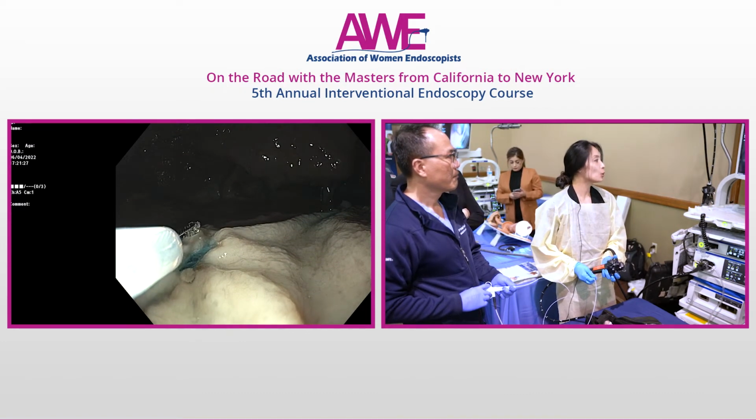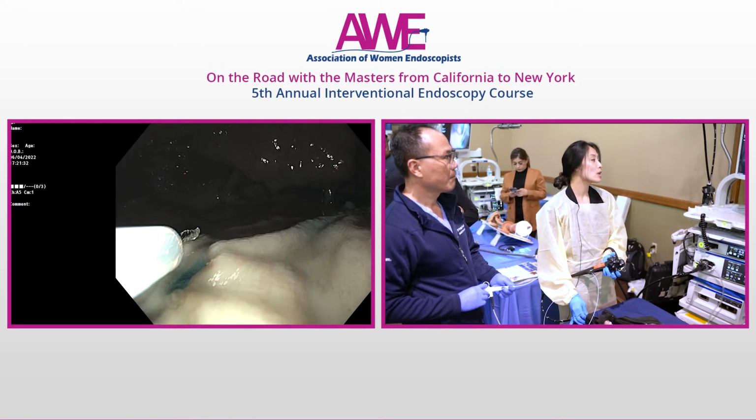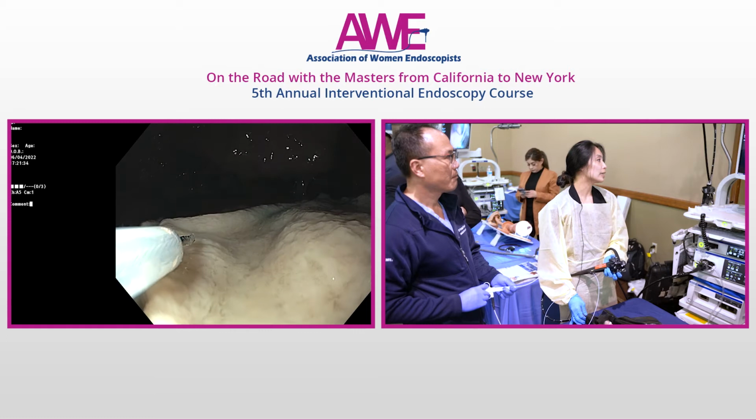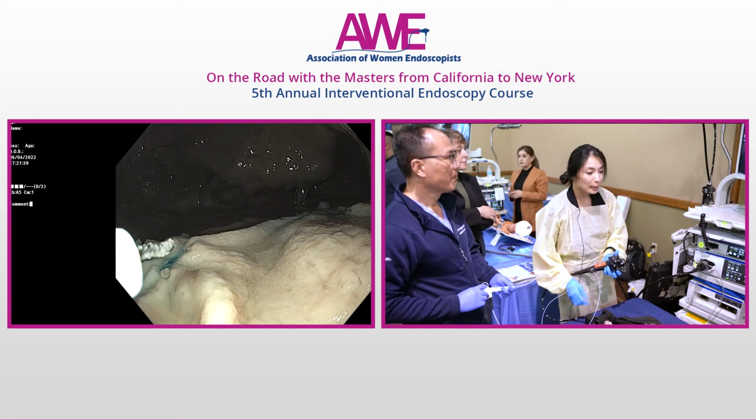And then, as mentioned in the lectures this morning, we can also use the snare tip to just go around the margin of the lesion to decrease the risk of recurrence. So we'll just get a little bit of snare tip.